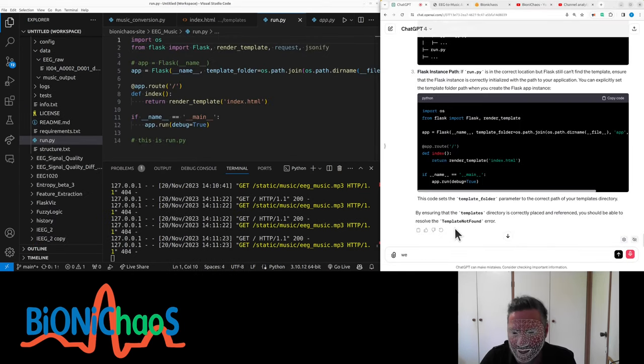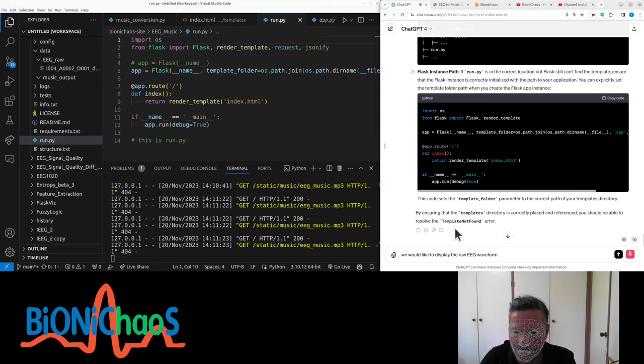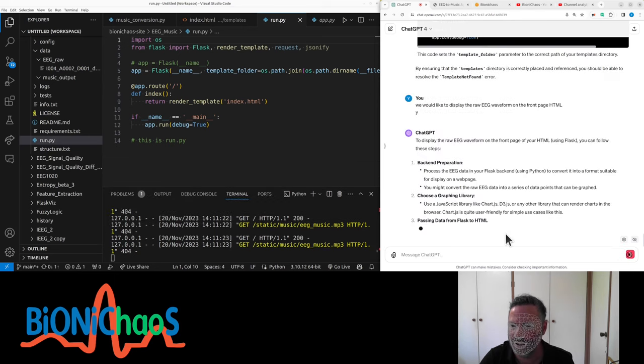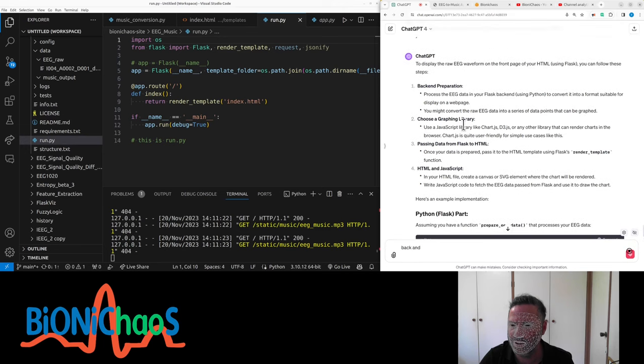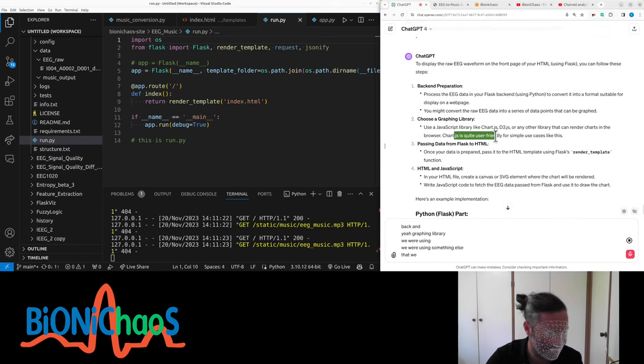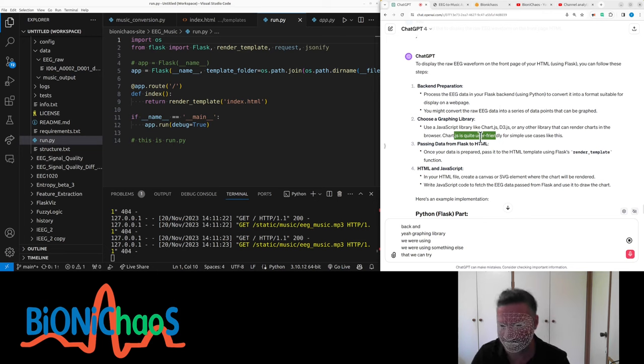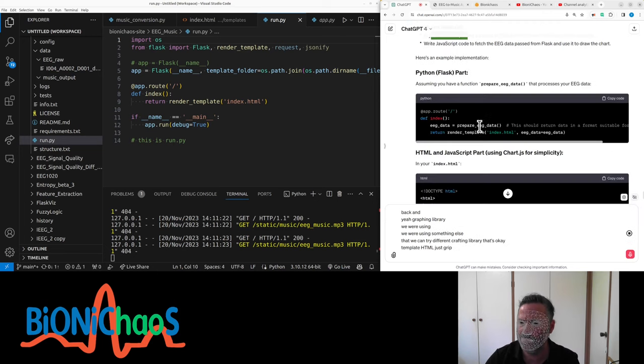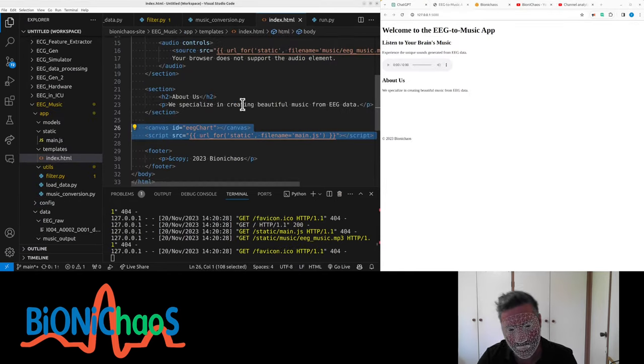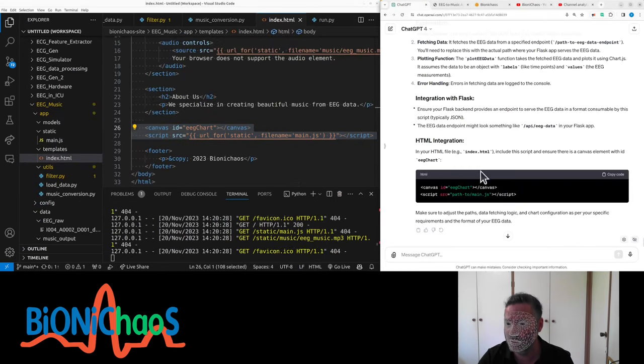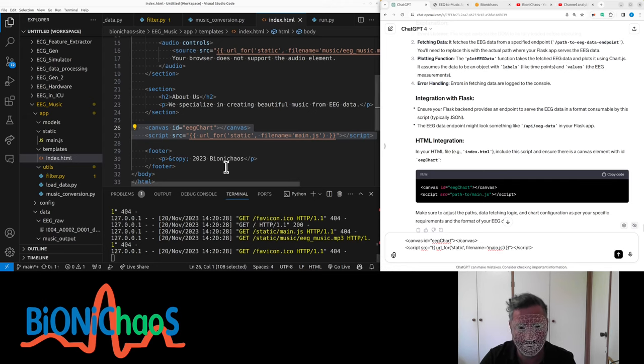Display the raw EEG waveform on the front page. HTML backend, yeah. Graphing library - we were using something else, but we can try a different graphing library. That's okay. Prepare EEG data. Okay, GitHub Copilot, can you learn from GPT-4 some more?